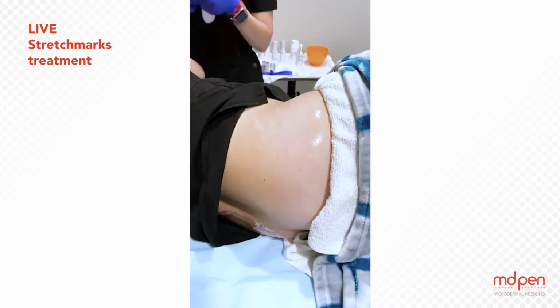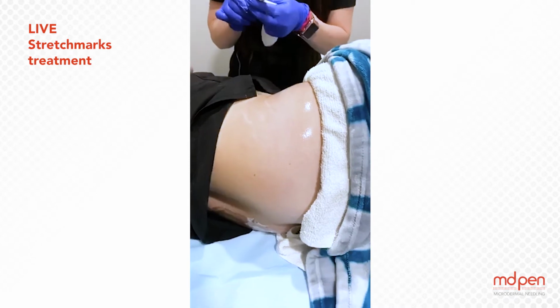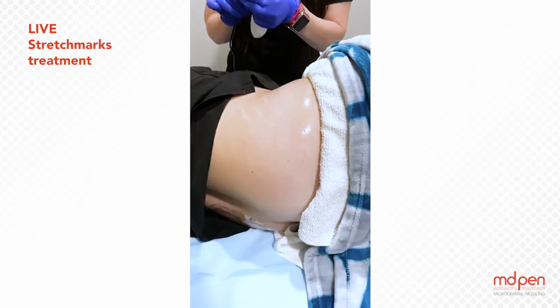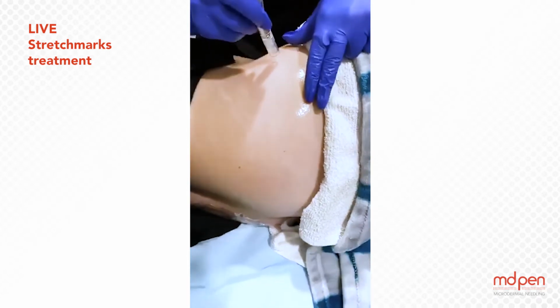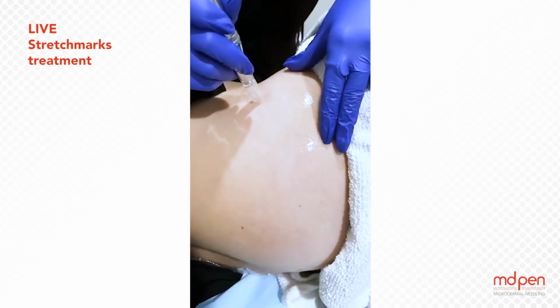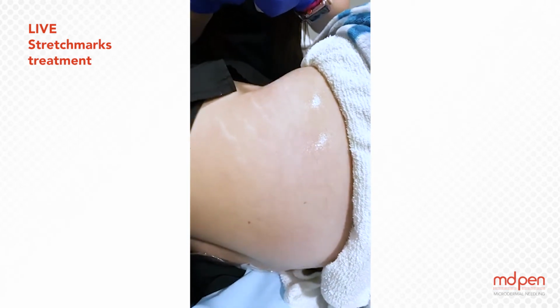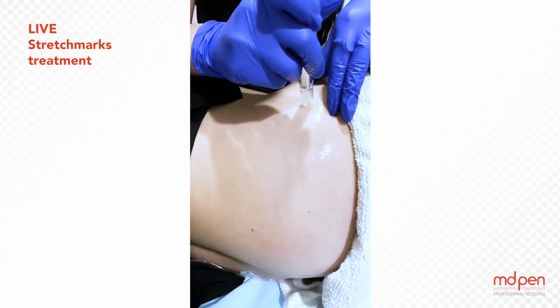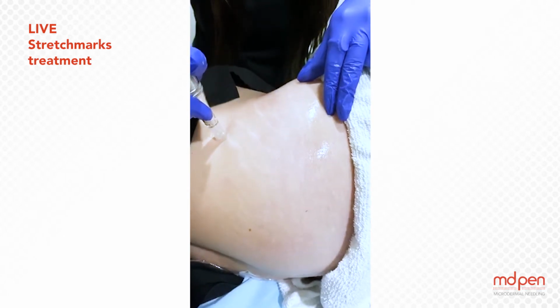So I set my pen to 0, put it on high. I'm going to put her at a 1 just to make sure she's pretty comfortable, and then once I get an okay from her, we can crank this up. Like I said, we need to be at 1.5. And she's given me the okay. My pen speed, for those of you asking right now, is at a medium high.